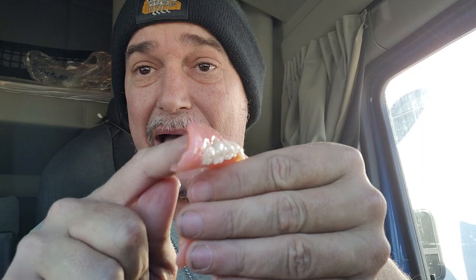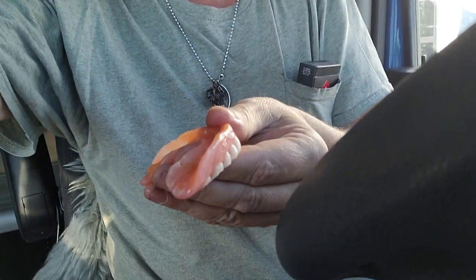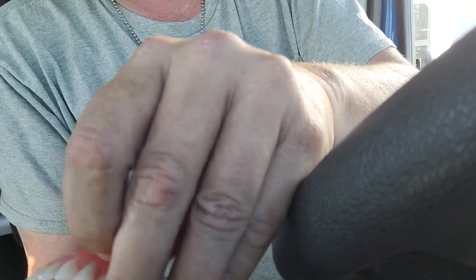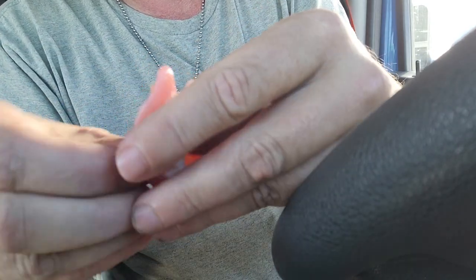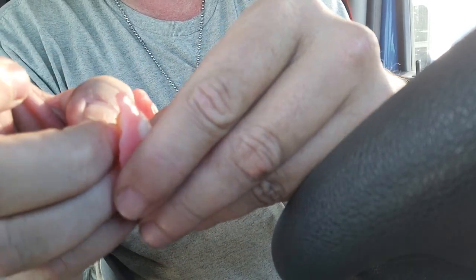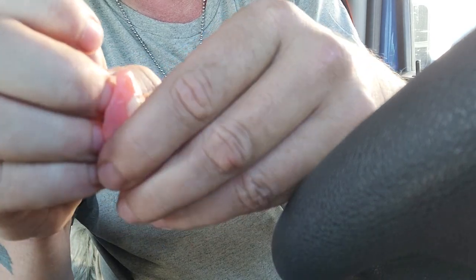You want a continuous line of it — you don't want to just put a little blip here and there. You don't have to put much, but you want a continuous line so you can pull it all out in one piece. I'm going to take it straight out of my mouth and pull it out — I'm just going to grab a little edge and pull it up, starting from over here.